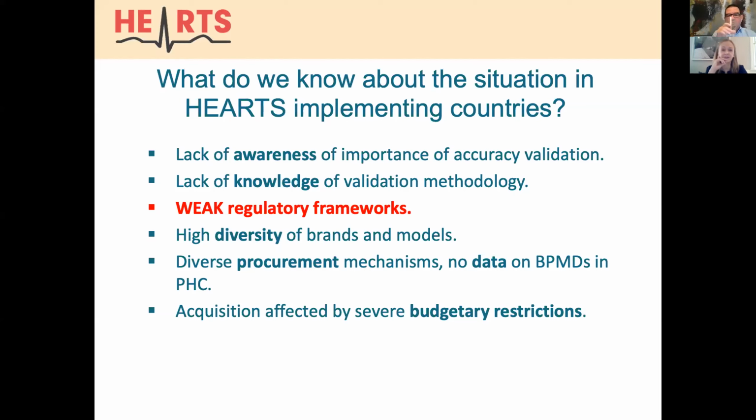Another finding is very weak regulatory frameworks, or non-existing ones. Basically, there's no regulation of blood pressure measuring devices, with very few exceptions, and we're going to go into more detail about that. There's a high diversity of brands and models. This Dr. Picon also mentioned as the same thing that's happening in Australia and in other countries. So one can find any models online or even at the pharmacy at the corner.